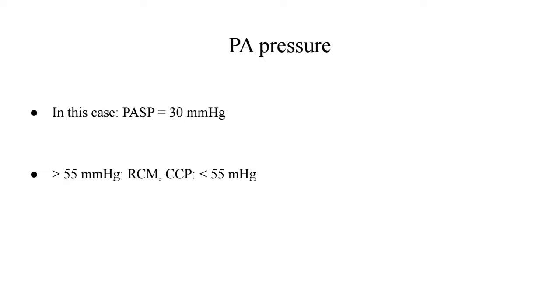The pulmonary arterial pressure was estimated using the tricuspid regurgitation jet. In our case, the pulmonary artery systolic pressure was 30 mmHg. To differentiate chronic constrictive pericarditis from restrictive cardiomyopathy: if PASP is more than 55 mmHg, it points more towards restrictive cardiomyopathy, whereas a PASP less than 55 mmHg, together with other hemodynamic findings, is consistent with chronic constrictive pericarditis.